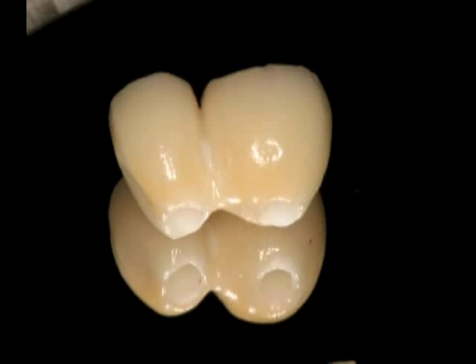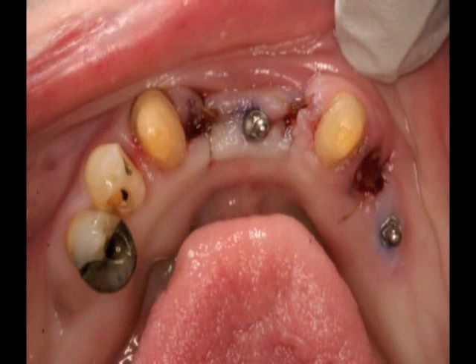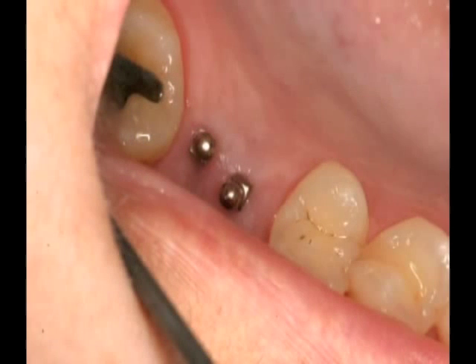Hello and welcome. This is Dr. Benjamin Oppenheimer. I'm pleased to share an exciting new option for patients that has changed the way I practice dentistry. In this video presentation, I'm going to be demonstrating a lower denture stabilization using mini dental implants. I chose the Imtec Sendex MDI system because of its track record and the quality of the products.